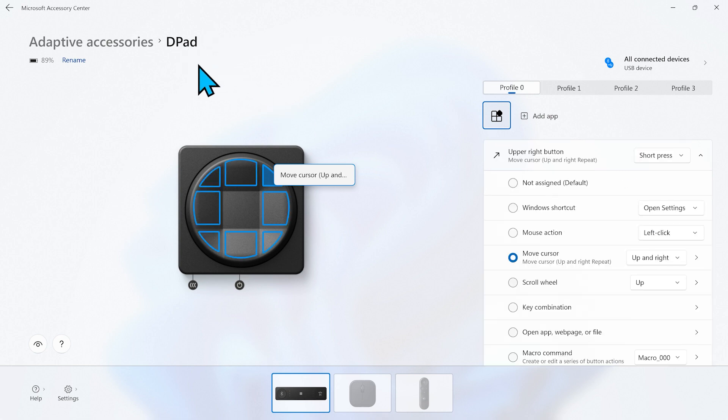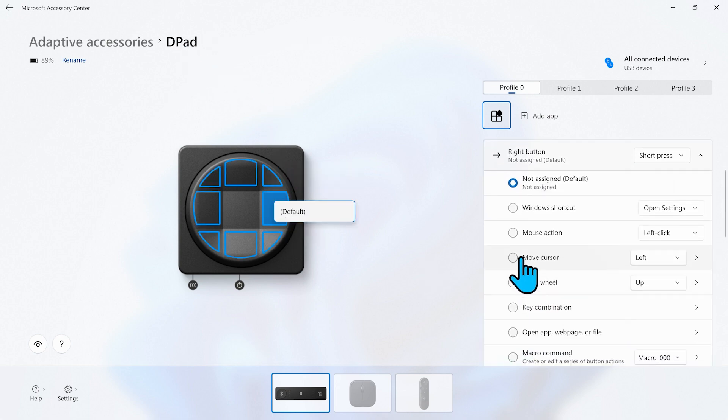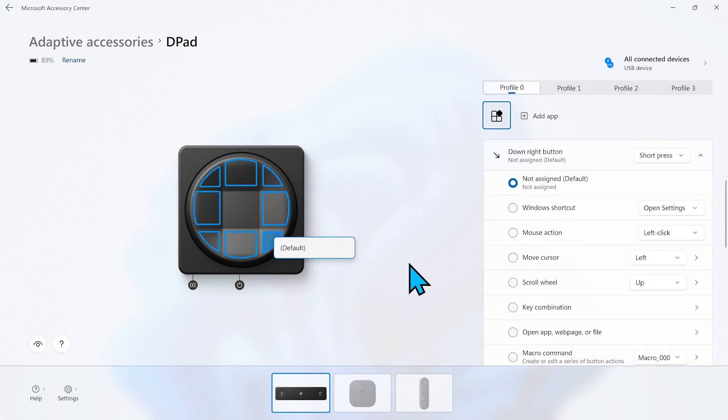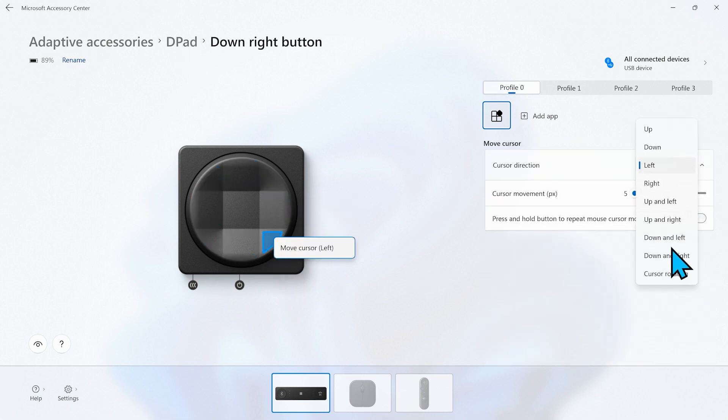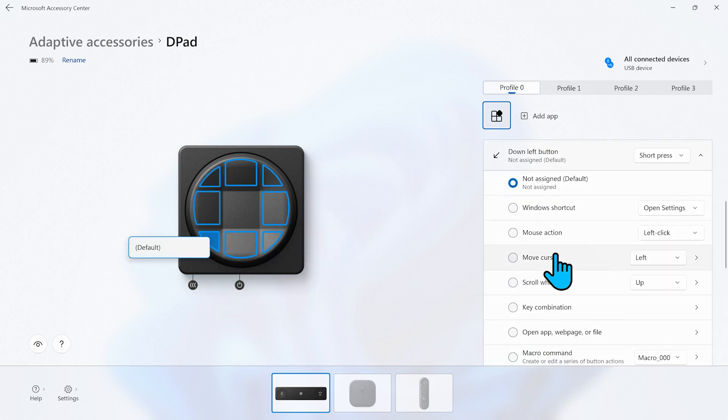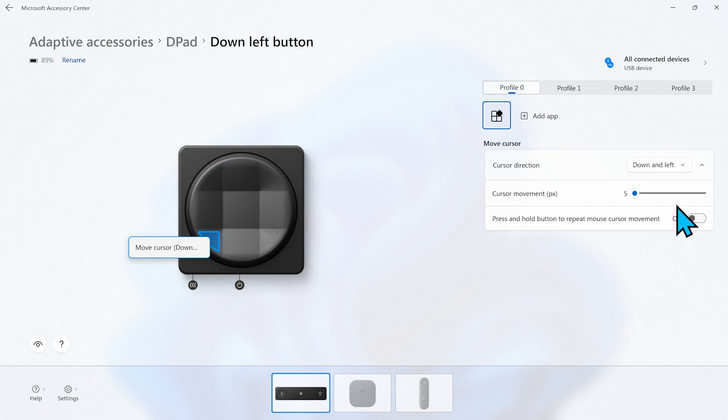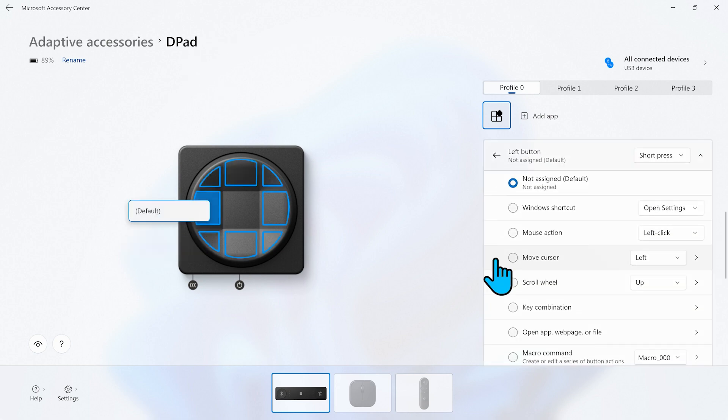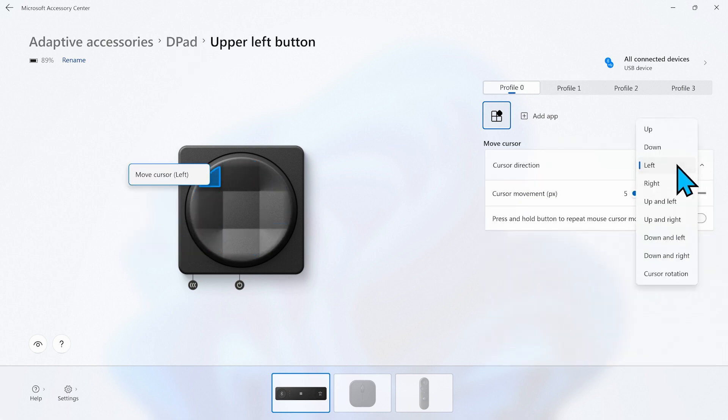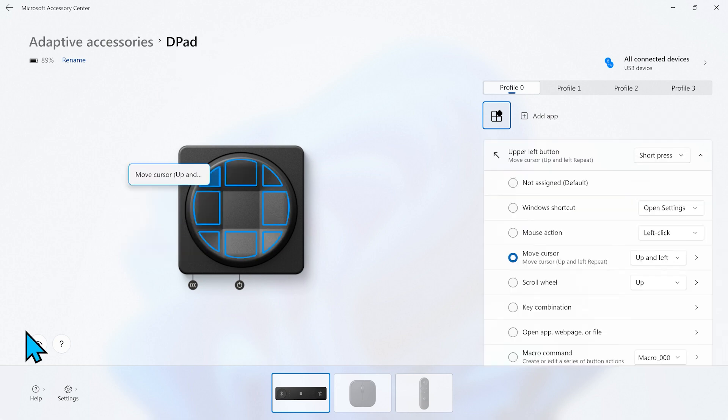We're going to continue clockwise and repeat these steps for all the other buttons until we have assigned all eight directions of cursor movement using our d-pad button. And that's how we set up our d-pad button as a mouse alternative.